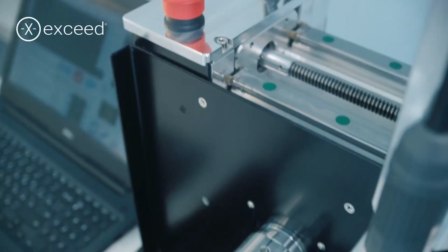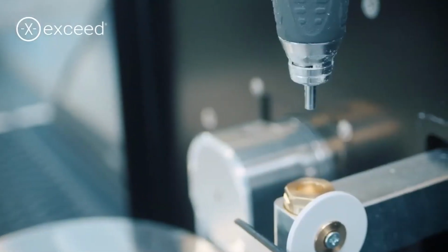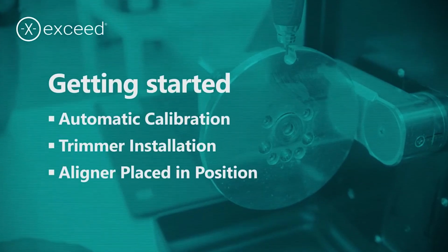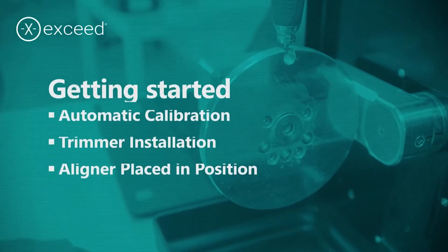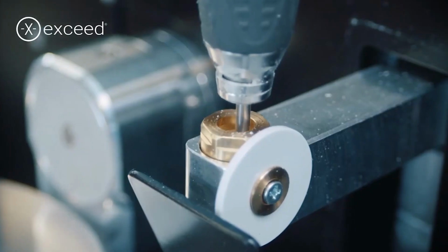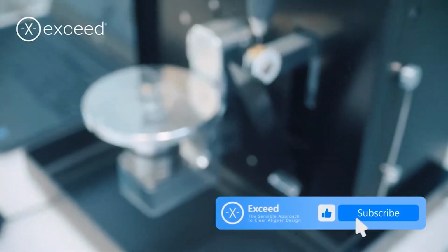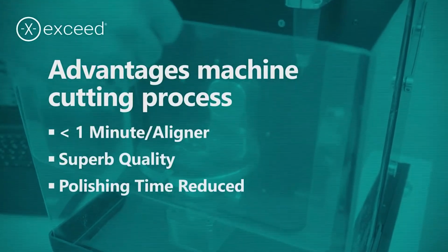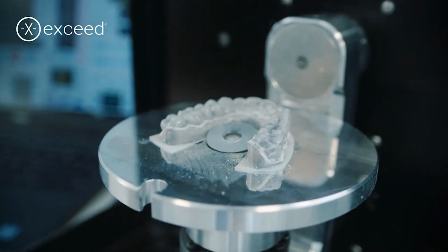But before I do so, let's quickly review the automated trimming module. Again, putting on a short video to illustrate the process. As you can see on the video, it is a custom-made device. It is not something you can buy off the shelf. You can use some trimming devices available on the market, but we personally didn't have a good experience with that because it's very hard to integrate it with our particular production process. So this is why we have our automated trimming device done for us specifically.